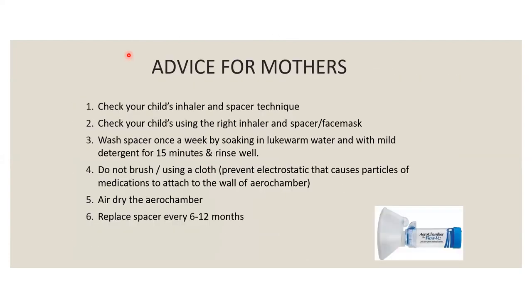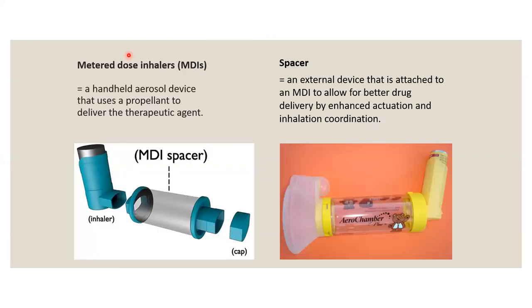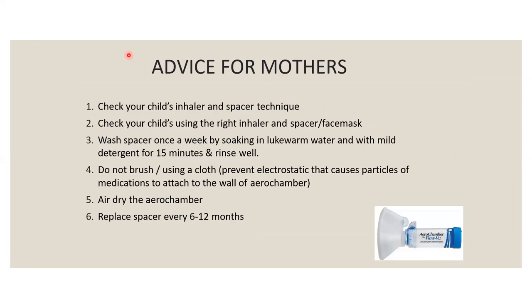What MDI is available for the treatment of asthma? What medication can be administered or delivered via MDI? Salbutamol. Okay, anything else? You have the steroids, fluticasone and budesonide. What else is there? Theophylline, there is no MDI. Combivent, which is a combination.